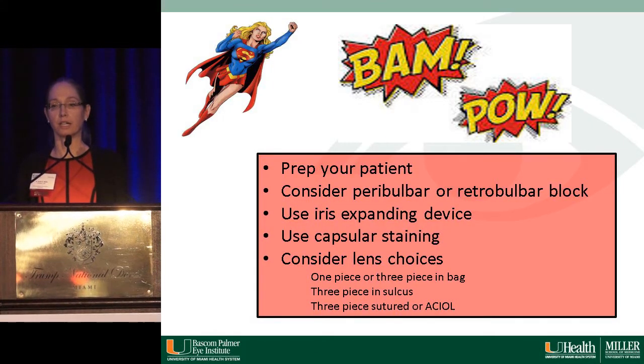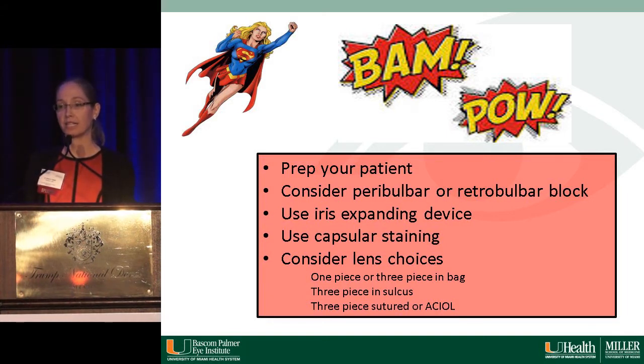I think we can really achieve very good outcomes in our pseudoexfoliation patients if we follow some basic premises to prepare our patients ahead of time that they might not have a 5-minute cataract surgery. I really like to consider blocking these patients. I think it's very difficult to deal with both a moving patient who might be in pain and also trying to do some sort of a secondary IOL at the same time. I also tend to err on the side of caution in terms of using capsular expanding devices, iris expanding devices, and capsular staining in these cases.